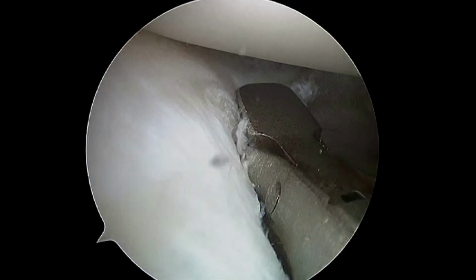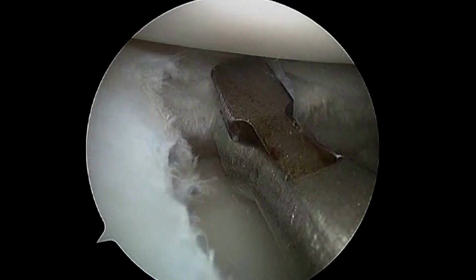Further shaping of the anterior horn is done and debridement is carried out. Meniscus punches are used from the anteromedial portal. One could see the difficult approach, and hence special meniscus punches like rotary and reverse cutting punches will be useful in this situation. A far medial portal can also be helpful.